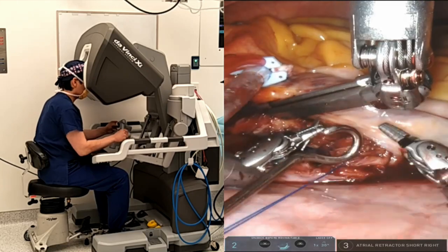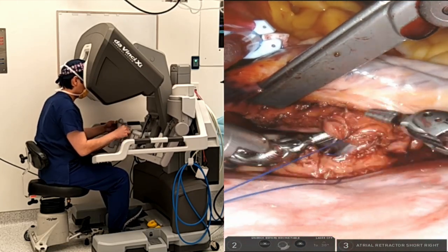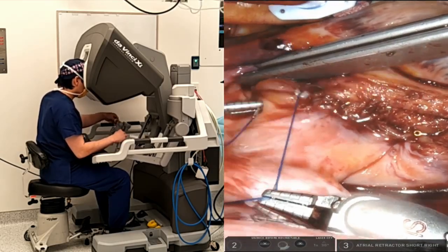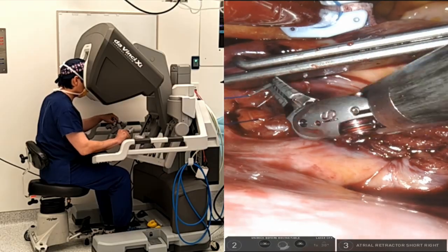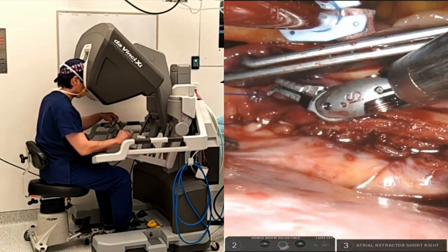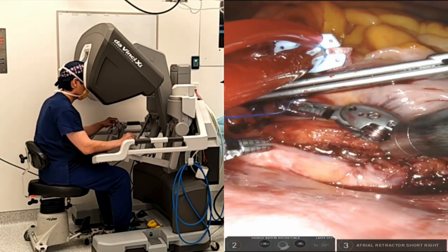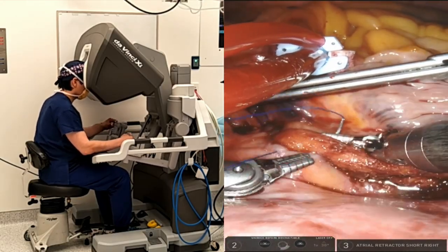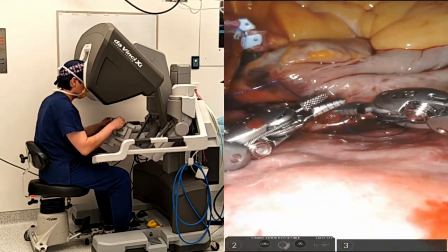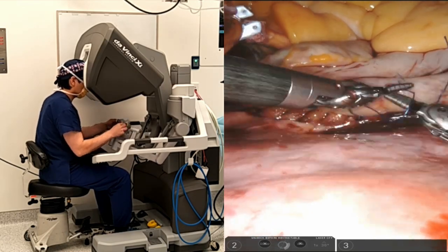Generally speaking, if you fully understand the structural cause of mitral regurgitation, trust the anesthetist with preoperative echo measurements, and if you follow the playbook and fix the mechanical problem accordingly, you are just going to get a robust mitral valve repair result. In my opinion, you will have a better chance to do so with the robotic approach, because of its unparalleled 3D visualization and enhanced bimanual tele-manipulation.